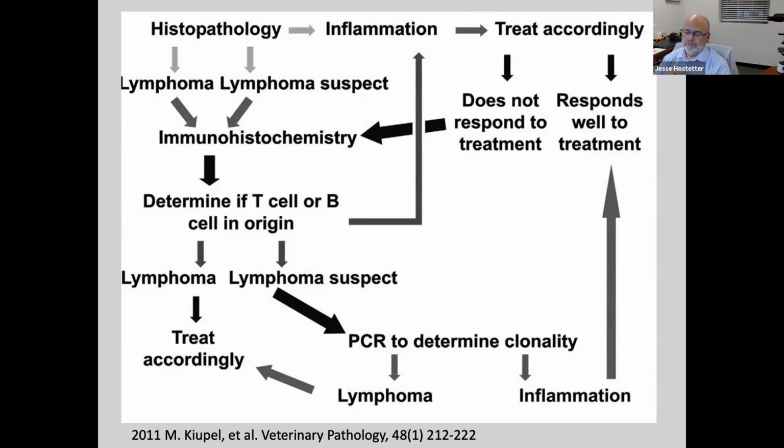I've talked to other pathologists. After a couple of these meetings, I've had some calls and we've talked it over. To the best of my knowledge, in that entity, whatever that is, it's not associated with disease. I describe it, I say it's there, and I say that we don't know what the significance is, but it's often not correlated with disease. And that's about the best we can do with that. At least I can do with that.